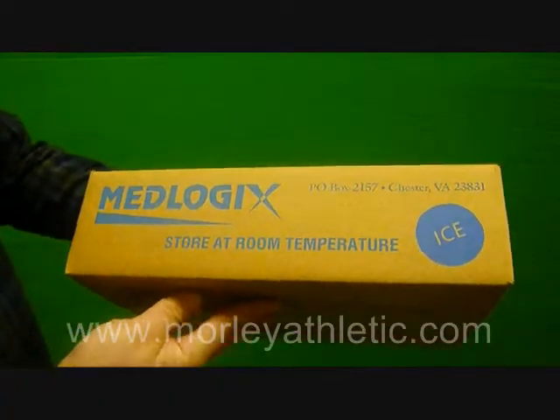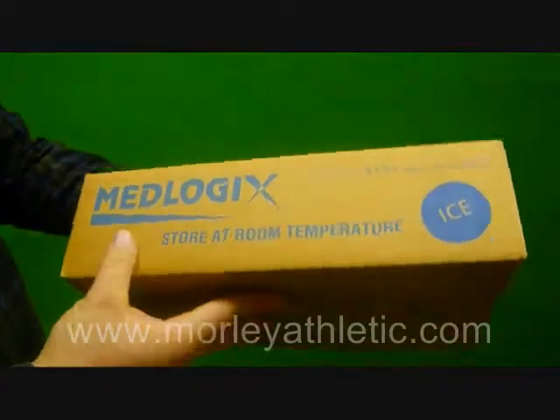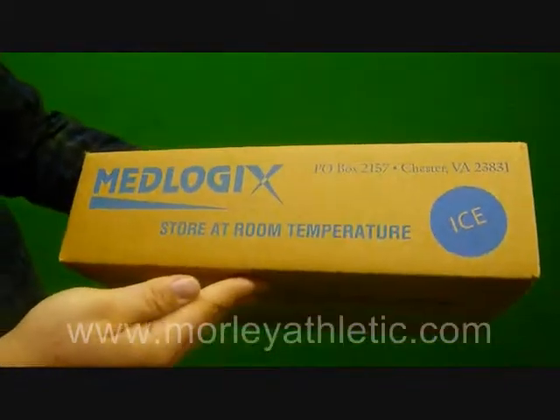Today we're going to take a closer look at the Medlogix Instant Ice Packs as featured on MorleyAthletic.com. This is the senior size — these are six inch by nine inch packs.